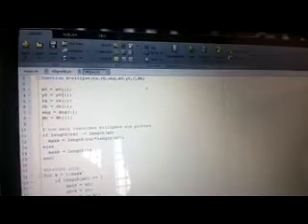Here we call the ellipse fitting program. By calling it, we do the ellipse fitting. Ellipse is nothing but taking 6 constant values x. For k equal to 1 to max k, if the length of x0 is equal to 1, then x position is equal to x0, y position is equal to y0. Radius of m is equal to RA of k, radius of n is equal to RB of k.